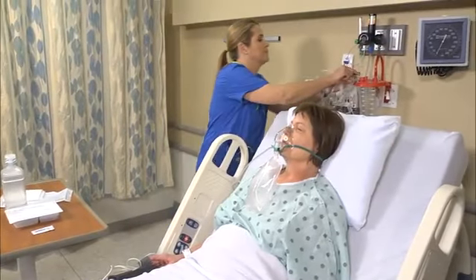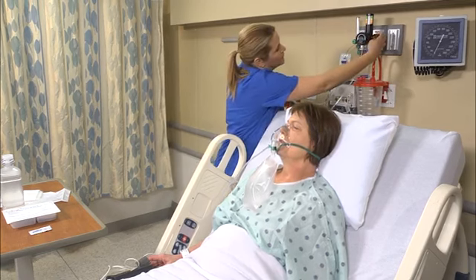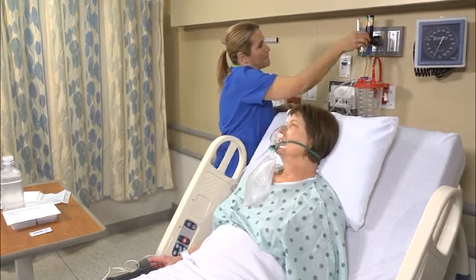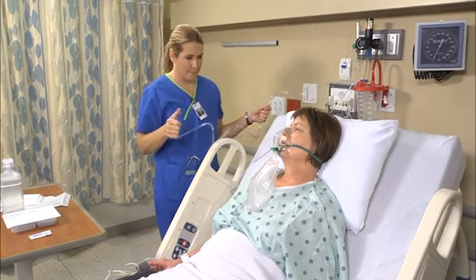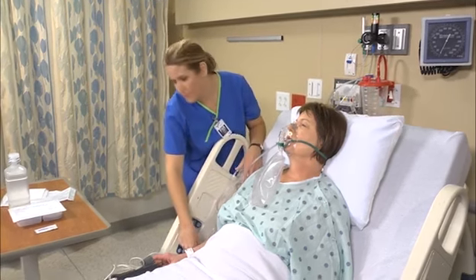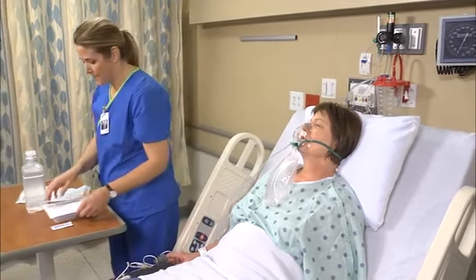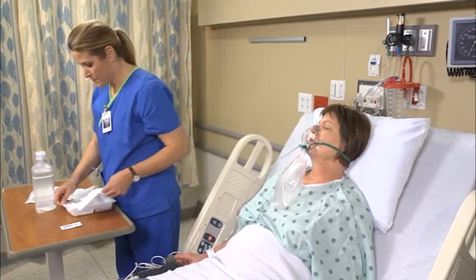Prepare your equipment by connecting one end of the tubing to the suction machine. Turn the suction device on and set the pressure to the lowest level possible that will effectively clear secretions. After checking the pressure by blocking the end of the tubing, place the open-ended tube near the patient within easy reach of your work area.